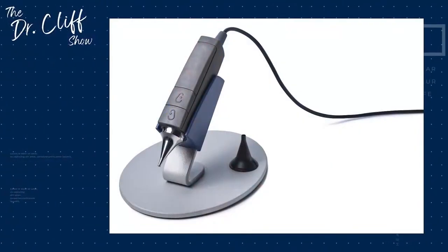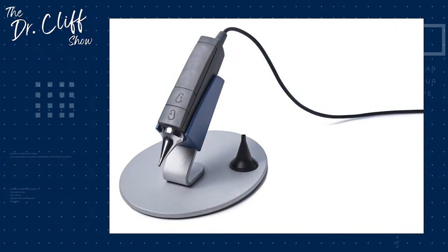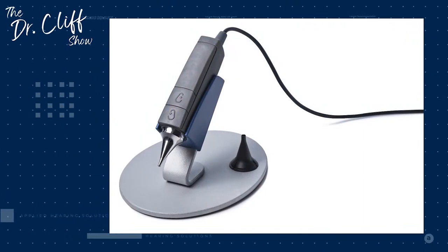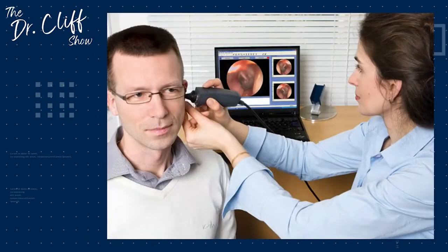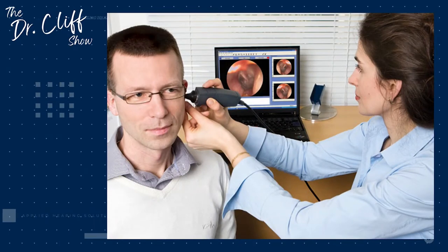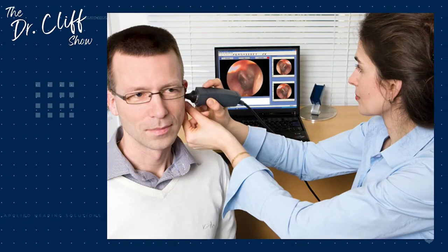But we actually use something called the Natus Otocam 300. This is a particular type of otoscope that we can do a variety of different things with that provides us with more additional value. So that's what it looks like on the desk. This is what it looks like when you're actually utilizing it. So the nice thing about this is that we actually get a nice full view of the ear canal, and it's blown up on the screen for us.